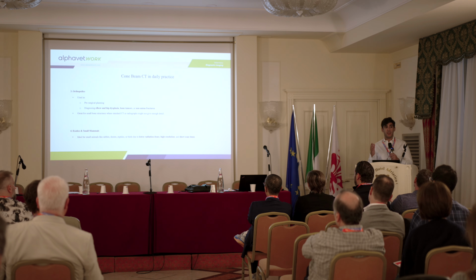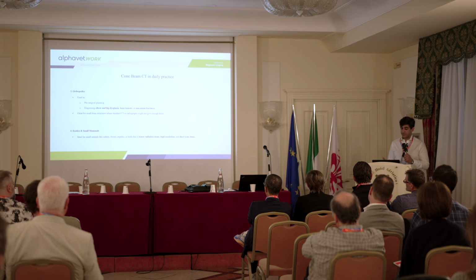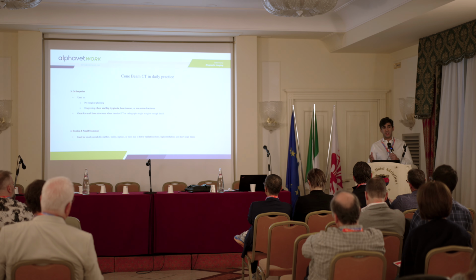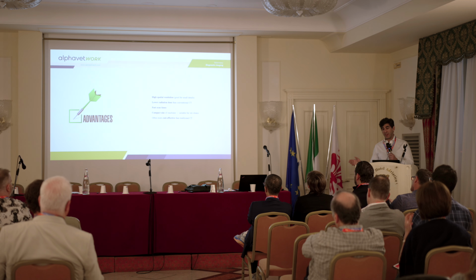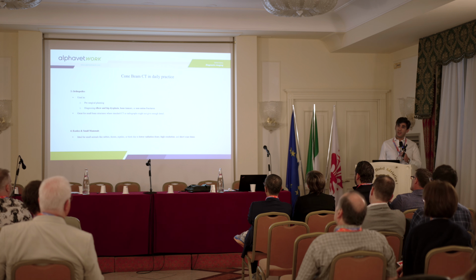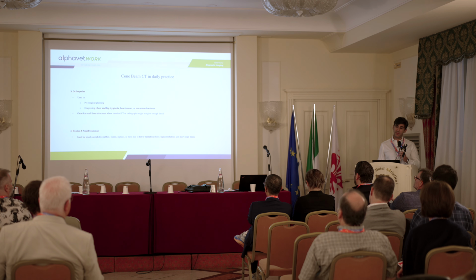If you consider small breed dogs, carpi, tarsi, I prefer it a lot. And obviously with exotic animals, as you know in your daily routine, you have pets from 50 grams to 65 kilos. So it's not easy to say that with one machine we can do everything well.